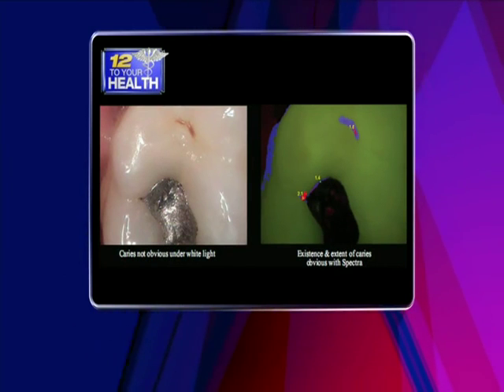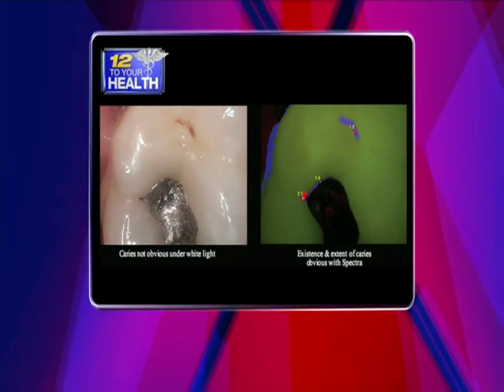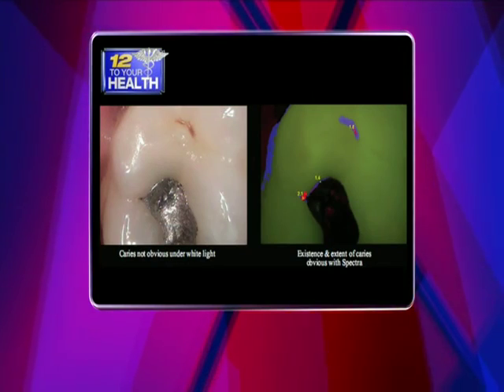You'll see it on the tooth, and it'll be able to locate the seriousness, the size, and the location of the decay. So the advantage of this over what you guys did before, was it X-rays that you used before? We used to use X-rays. We still use X-rays to show decay in between the teeth, and sometimes if it's deep decay. But on the biting surface of the tooth, we always depended on a sharp explorer, a probe that went down there. And sometimes we'd say, yeah, there might be decay there, there might not be decay. This tells us 100% that there's decay in the area and the extent of that decay.